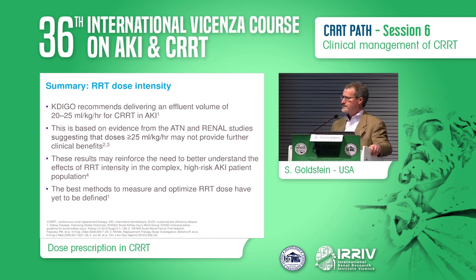What is important to say is that we have not evaluated RT doses below 20, and I don't think anyone ever will, but this should not be inferred to suggest that dose doesn't matter.